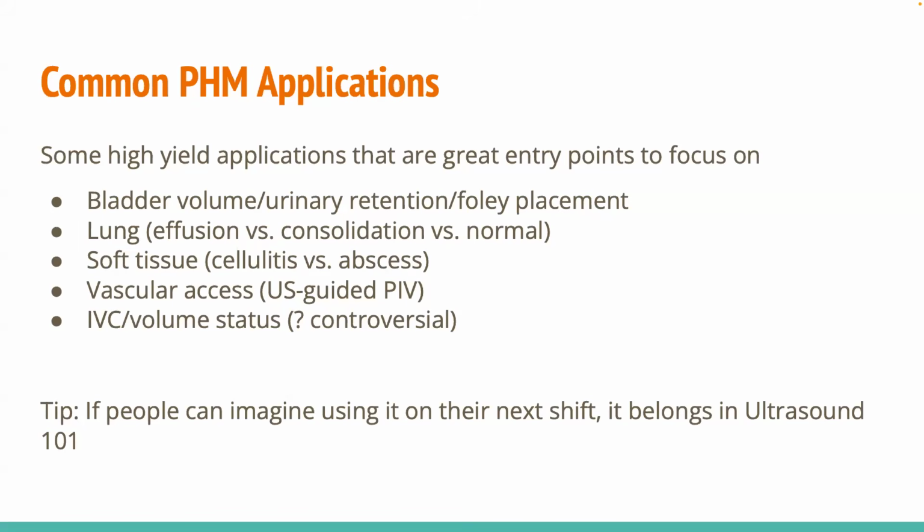Vascular access seems to be, of course, the residents, the medical students, and the nurses seem to have gotten more out of the ultrasound guided PIV portion than I feel like my attending colleagues did. But that may be institution dependent. And then you could do IVC volume status; doing that in general is kind of a hot topic.